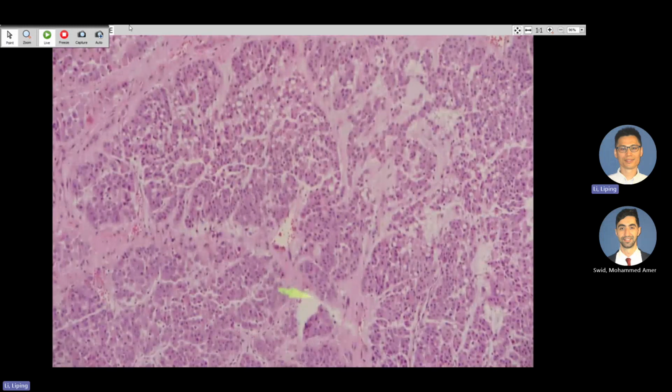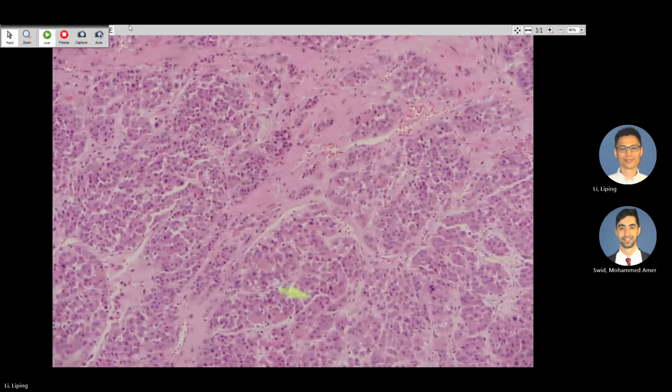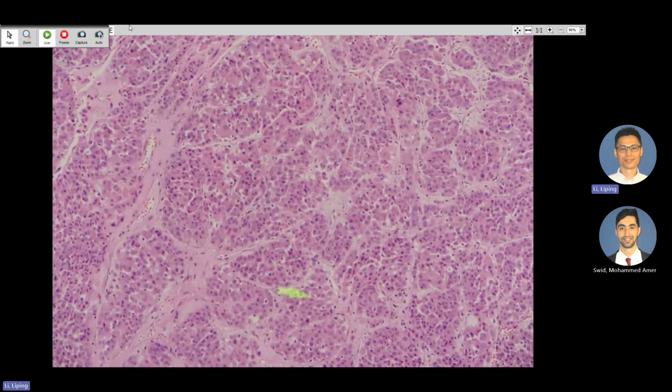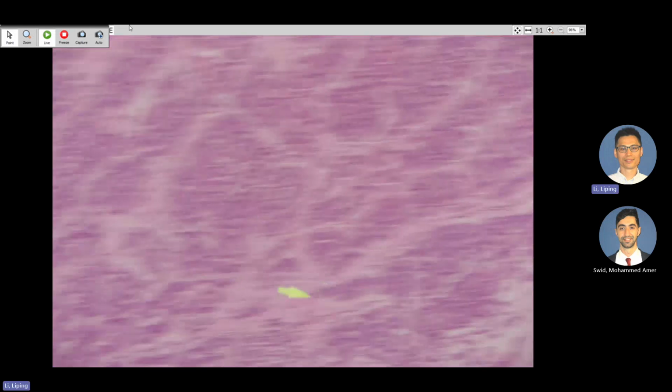But the previous one was a pheochromocytoma, right? Yeah, like the major tumor. The previous one also had lots of large cells, that kind of thing. So this one is signed out because they can find more than 5 mitotic figures in 50 high power fields. So they sign out adrenal cortical carcinoma in this one.